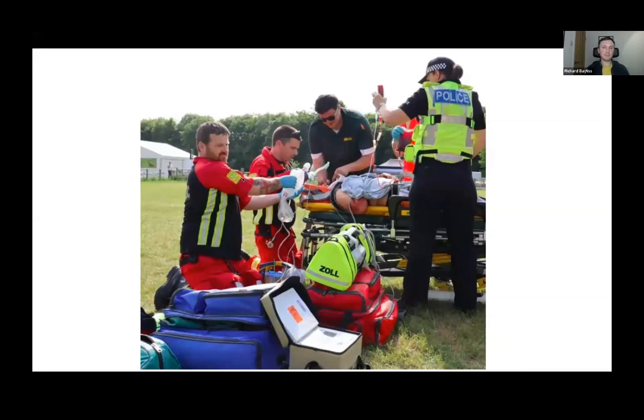Some pre-hospital services have taken this one step further, and they routinely use a videolaryngoscope but turn the videolaryngoscope screen away. So they use it for direct laryngoscopy, and there's that shared situational awareness with the airway assistant. But if there's any challenge with the intubation, they can just turn the screen around and they've instantly got a videolaryngoscope in use.